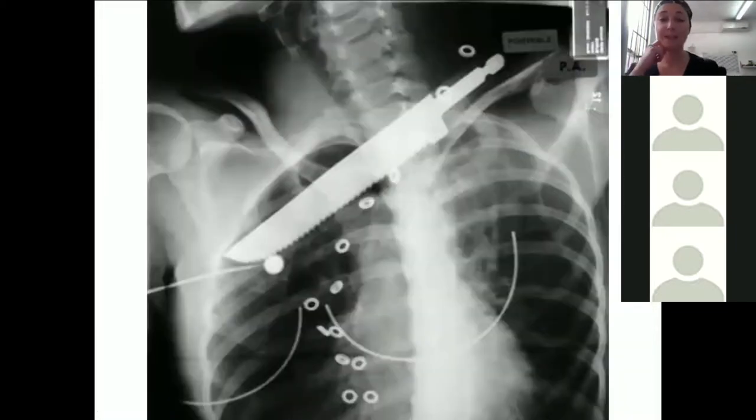Oh, this one you can't really miss. What extra is going on there, aside from all the ECG dots and the fact that there's probably an underwire bra, you can't really miss the fact that the patient's been stabbed. It's unusual to have an x-ray like this. Usually it's blatantly obvious when you can see the patient, but you might want an AP and a lateral to work out exactly where your knife is. So you might end up seeing x-rays like this.